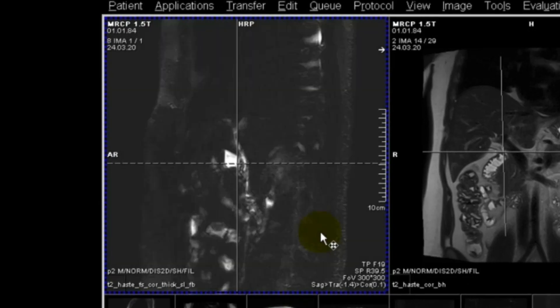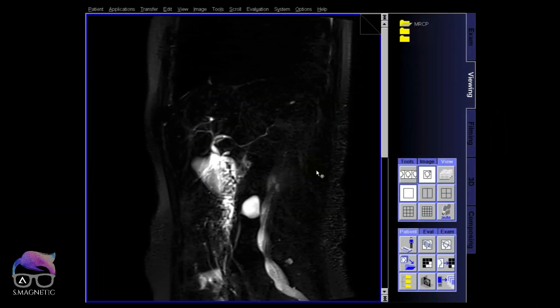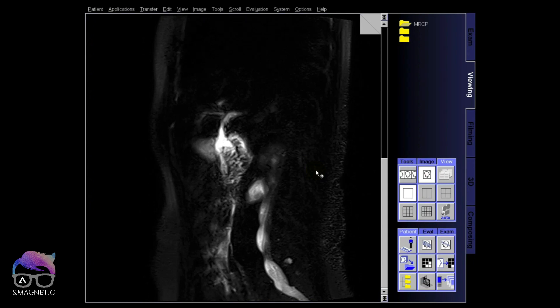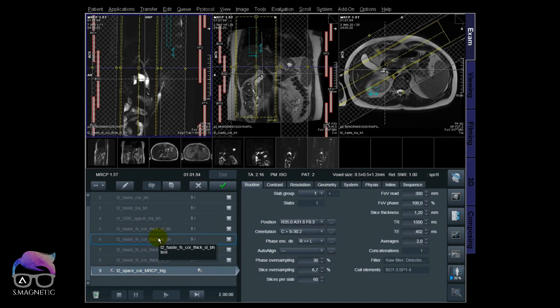I'll explain the difference between breath hold and free breathing thick slabs. It's not always easy to see the big difference, so here's a comparison from another case: the position of the free breathing is different from the breath hold. I'll need the free breathing image for positioning my thin slices. I copy the oblique coronal — many people do this as a direct coronal but I prefer oblique coronal, and I'll explain why later.